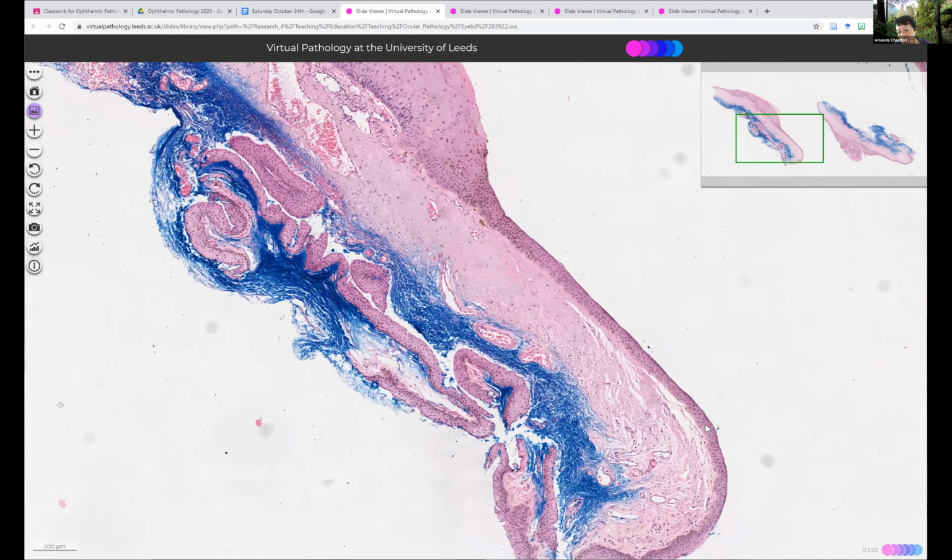However, when we were looking in our breakout room, we found mitotic figures. This is parabasal, but there was also an abnormal mitotic figure. Actually, I'm not sure if that's a piece of dirt or not now, looking at it closer myself. It's a tripolar one I can see, like we were wondering if this is a tripolar mitosis.